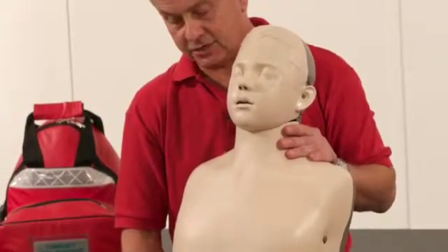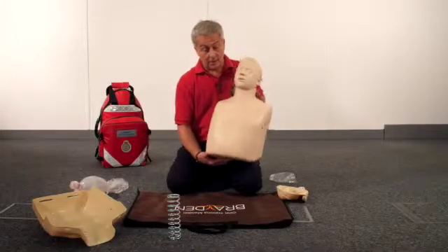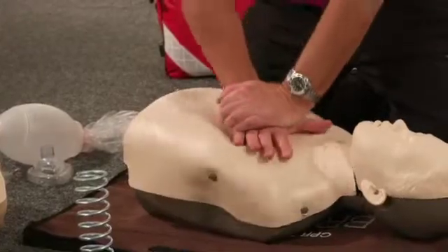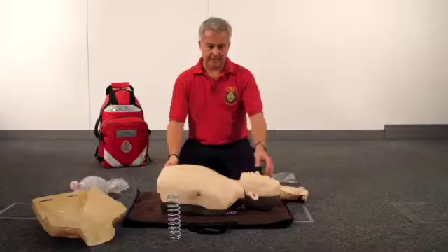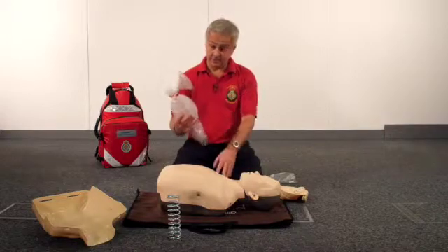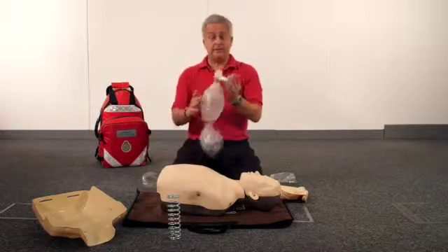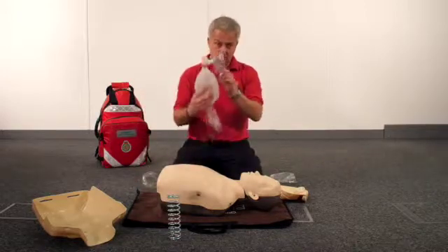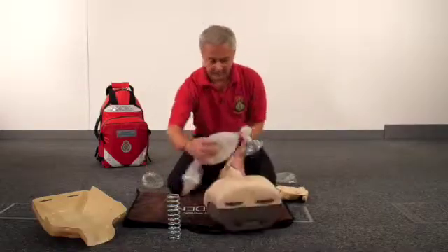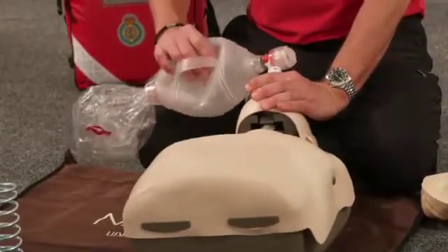The lights work in exactly the same way as the adult mannequin. The force needed is roughly half the force that's needed for the adult mannequin. You can also ventilate it in exactly the same way as the adult mannequin — you could use the adult mask if you wish, but if you want to be more realistic for ventilating a child, you can use a bag valve mask with a junior mask, and the mannequin will work perfectly well with representative chest rises.